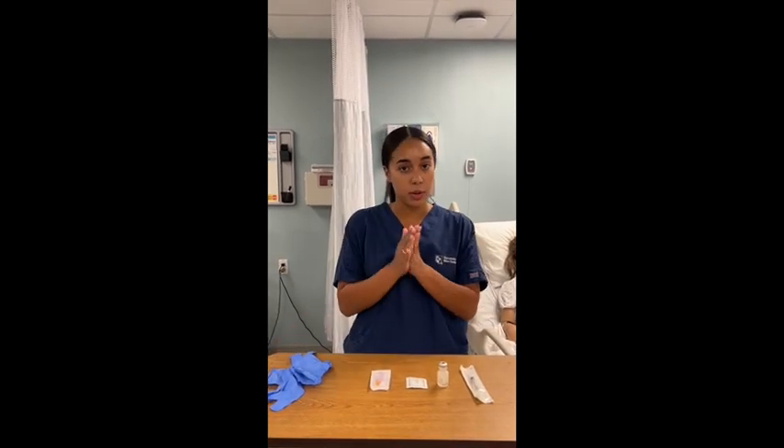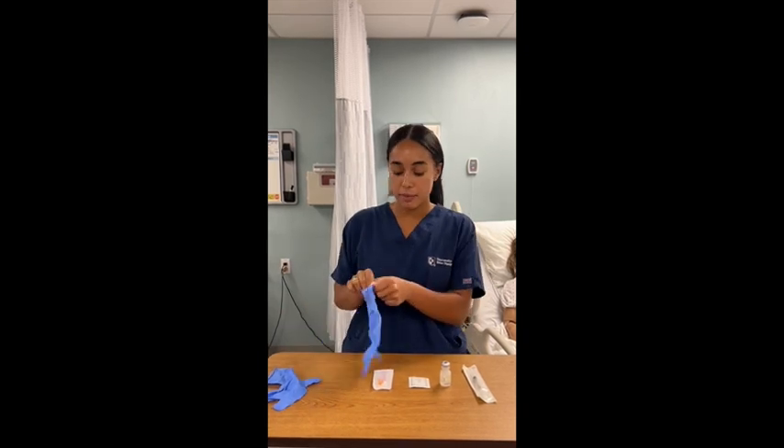Hi guys, I'm going to be showing you how to draw up a medication for an IM injection. So first I'd want to perform my hand hygiene. I'm going to put my gloves on.